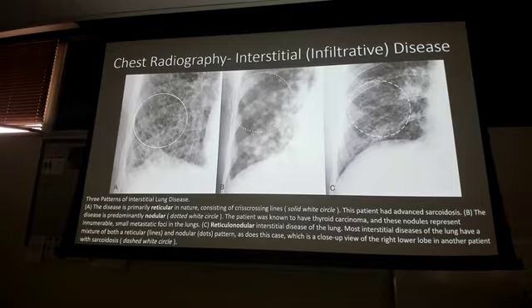But honestly, don't get hung up for Tuesday. Don't get hung up distinguishing between reticular and nodular, sure. But as far as trying to pull out a reticulonodular compared to one of these two, if I were you, I wouldn't spend a whole lot of time trying to figure out, is this reticulonodular or is it just reticular?